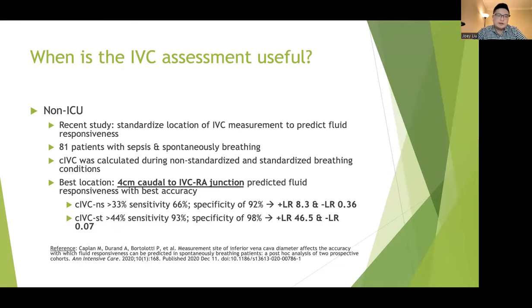In this study, the authors tried to determine what is the best location that corresponds with fluid responsiveness. They took 81 patients with sepsis who are spontaneously breathing, not on any sort of support, and evaluated them through standardized breathing and non-standardized breathing.